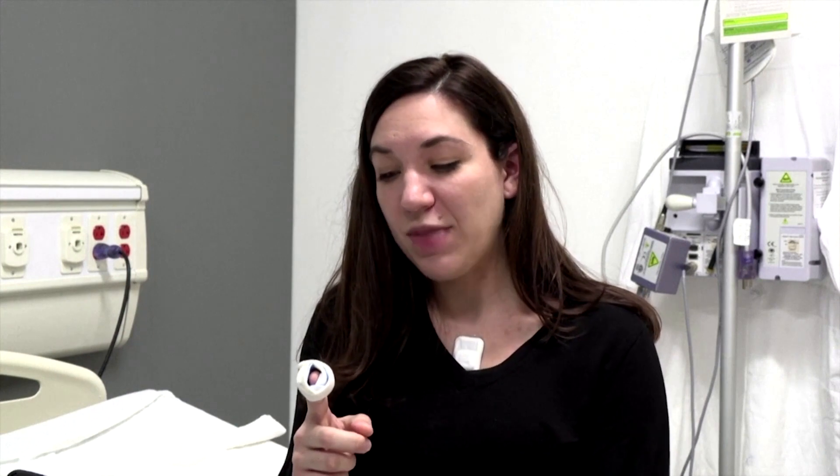The finger sensor gives your pulse oxygen levels, pulse rate, and temperature at the periphery.